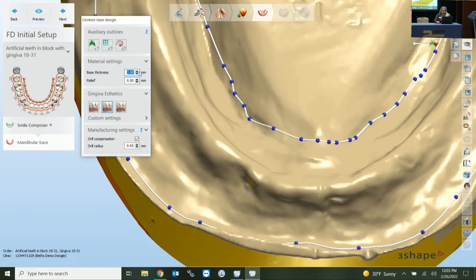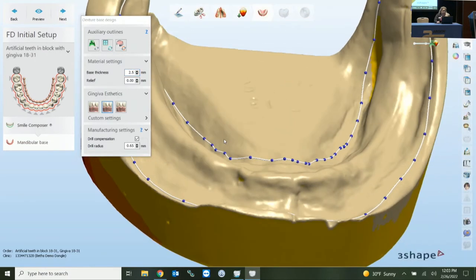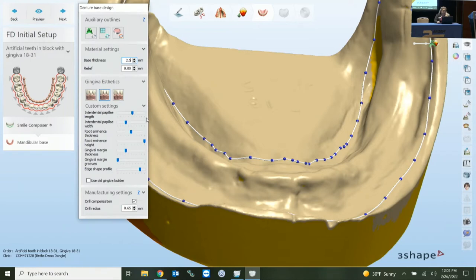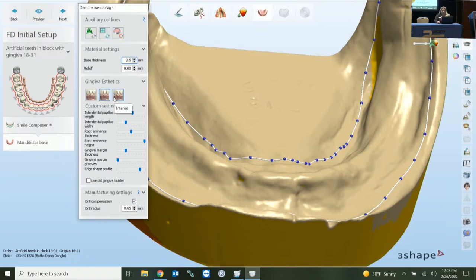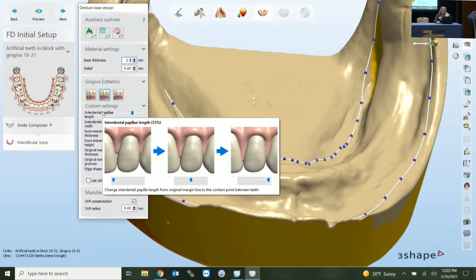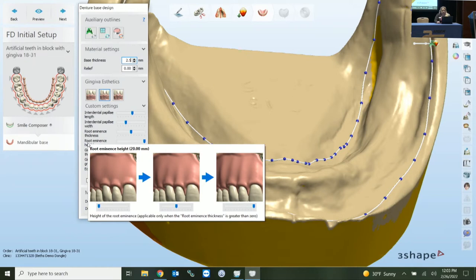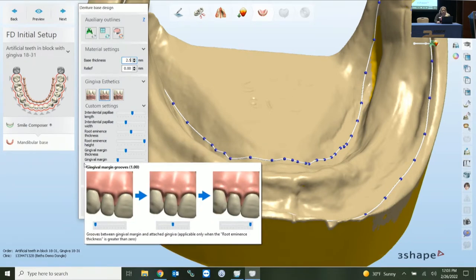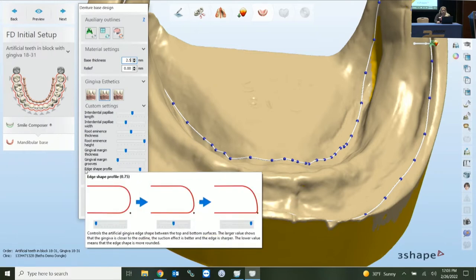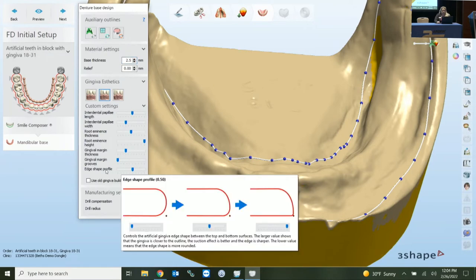With the three boxes, 3Shape calls it the Gingervator 3.0 — you have three quick-start options: delicate, natural, and intense. With natural selected, it appears blue. You have sliders to customize specific areas, and 3Shape gives you great visuals so you know which slider affects the gingival margin, the grooves, and the edge shape profile. This menu is specific to version 2021, so you need to be updated to 2021 to have this feature. Just slide it and it gives a great visual.